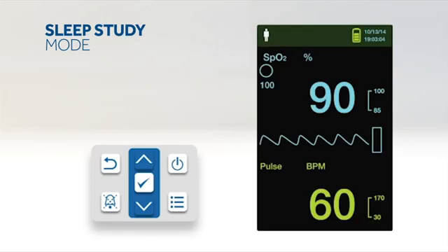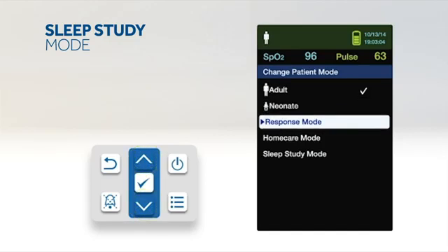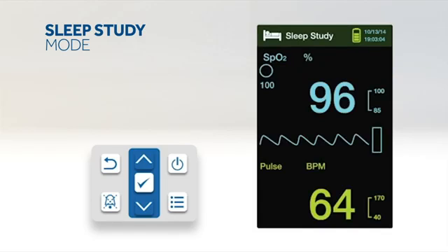When a sleep study will be performed on a patient, set the monitoring system to sleep study mode. The alarms will be silenced and the screen will be dimmed. To set sleep study mode, access the change patient mode menu, press up or down to highlight sleep study mode, and press OK to select. Enter the four-digit passcode and select confirm to enter sleep study mode. If buttons have not been pressed for three minutes, the screen will dim; press any button to brighten it. To return to standard mode, access the patient mode menu and enter the passcode.